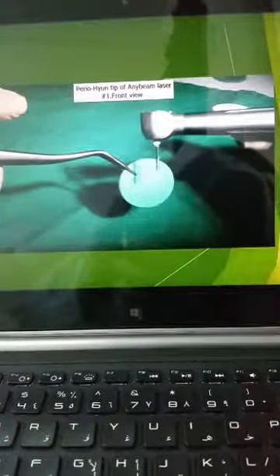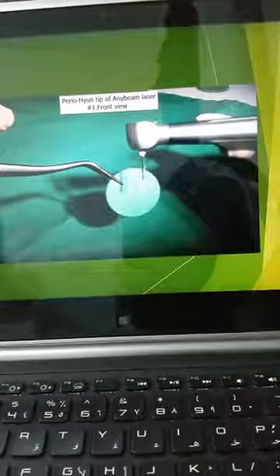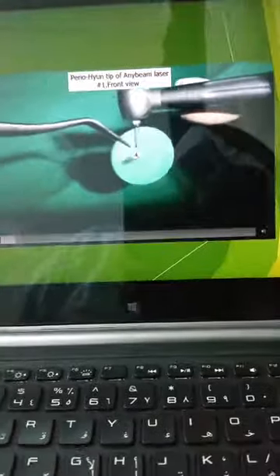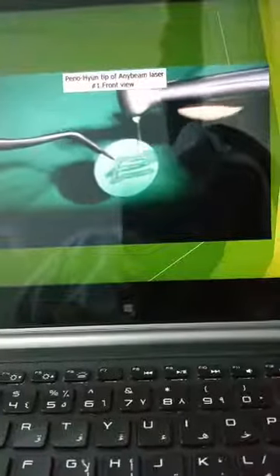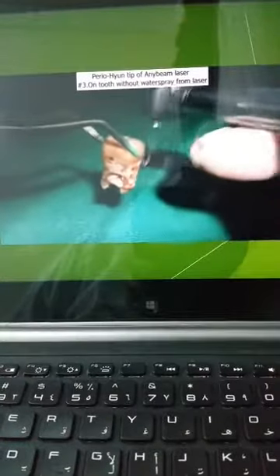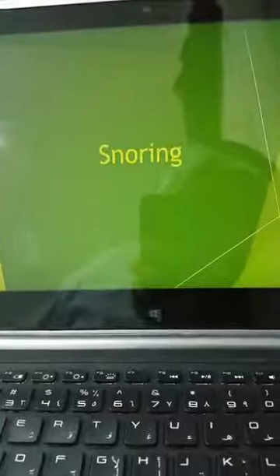There are today's tools for the implant. This is the laser where it can come at 90 degrees to the surface of the implant. The laser comes from the side, and this is a beautiful thing, that you can treat the space of the implant, and laser is the best for peri-implantitis, and there's no doubt that it has an effect on this. Look at here. Also for the root surface, Er:YAG is one of the best tools to treat.